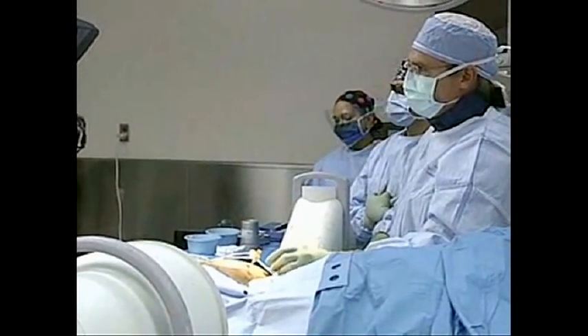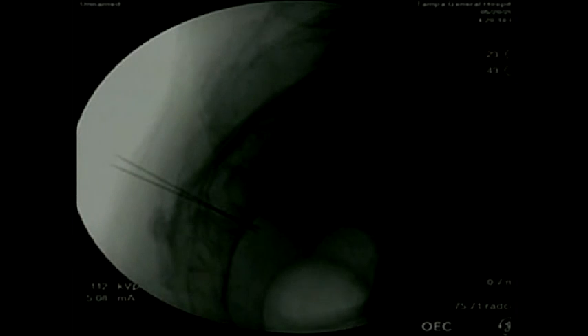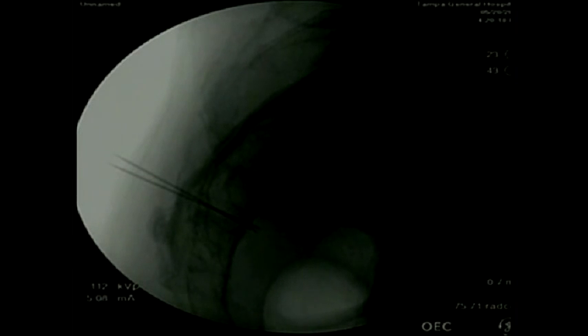I was able to find the foramen on the right side, the S3 foramen. On the x-ray image you can see two needles that are crisscrossing — one on the left side and one on the right side. The tip is just beyond what we consider the ventral portion of the sacrum, right at the very margin of where the nerve enters into the pelvic space. Having placed the needle, I'm going to go ahead and stimulate using the compound muscle action potential to identify if there's any response.